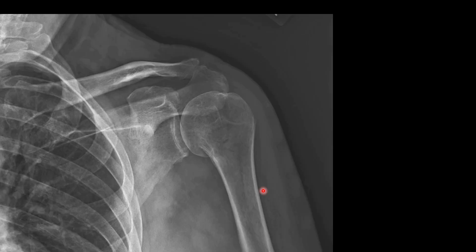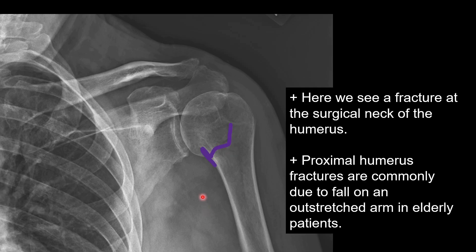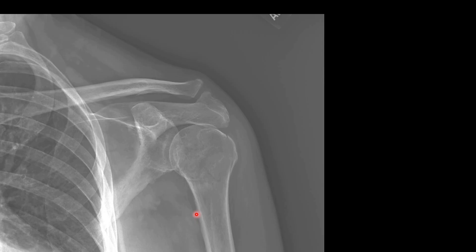Here's another patient who presented with shoulder pain following a trauma. If we follow the contours of the humeral head, we can see that there is a fracture of the surgical neck. These proximal humeral fractures are commonly due to falls on an outstretched arm in elderly patients. Anytime we have one fracture, we should always be searching for more. On this view, we also get a good look at the greater tubercle and can see extension of the fracture to the greater tubercle.